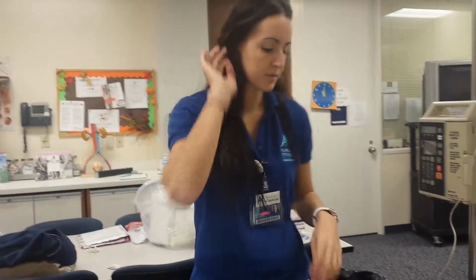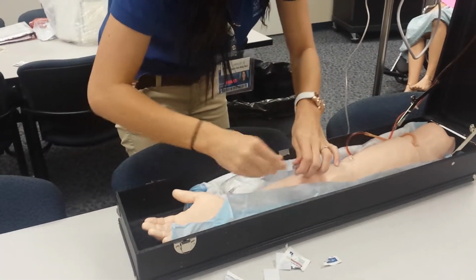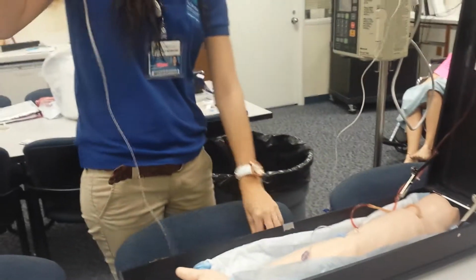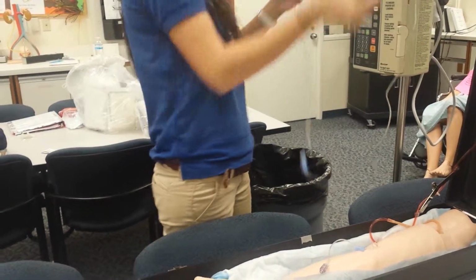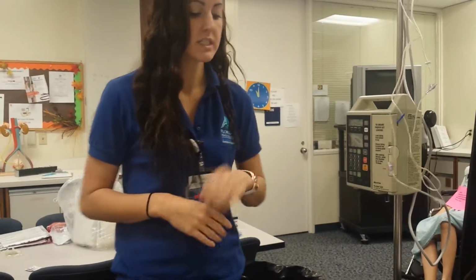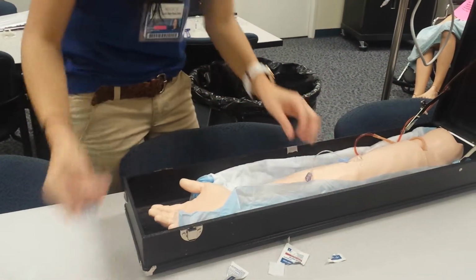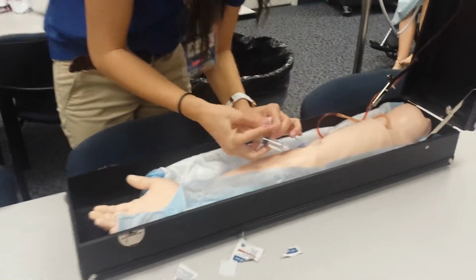Then when I come back and it's done, I'm going to disconnect the line and close the roller clamp to stop the flow. I'm going to apply some sort of clamp to keep this sterile so they can use it for the next set of antibiotics if it's within 24 hours. And I'm going to flush this line once more to make sure that it is still patent.